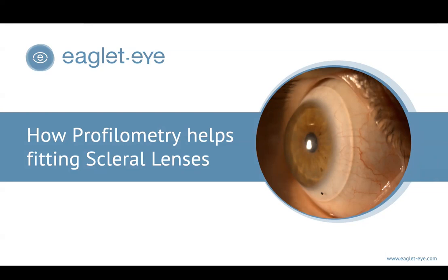And the cool thing about a unit like this is that it really has the capability to fit a variety of different things in the clinic. So that's why we lean on it a lot in the clinic and measure every single contact lens patient, no matter what they're having. We don't run ESP on a standard eye exam that wears regular contact lenses, but every specialty lens fit in our clinic, we'll run an ESP on. And again, the reason why: understand ocular shape, figure out what we're dealing with, pick our lens, and figure out how we can design something a little bit more effectively and efficiently.